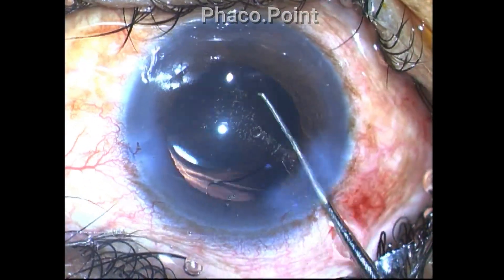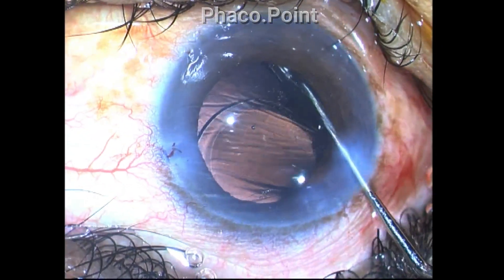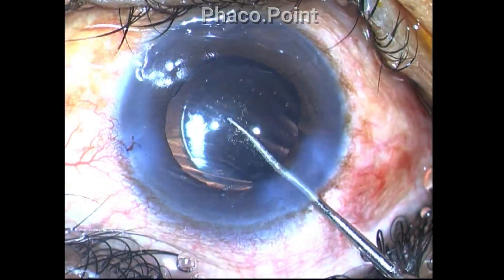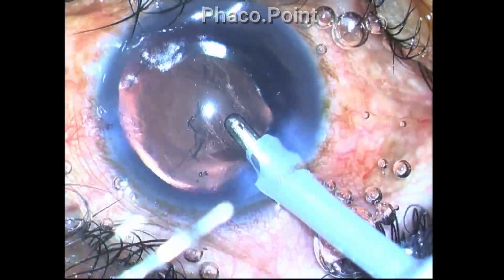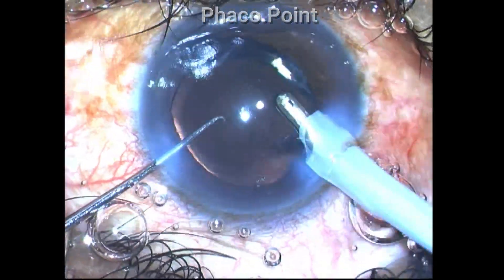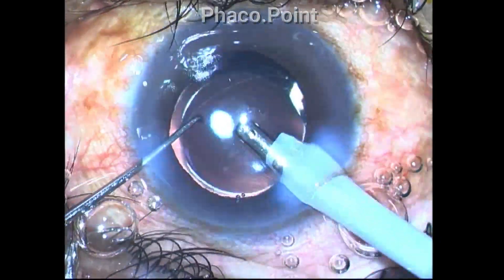It is at this point that I realized what the real problem was. When I tried to dial the lens, I found that the leading loop had punched a hole in the equator of the capsular bag. When I pulled it out of this small hole and dialed it to the horizontal position, the lens automatically centered. The discussion here is an inferiorly subluxating intraocular lens — the cause most likely being a break in the posterior capsule, because if there was an inferior zonular dialysis, the lens would have decentered in the upward direction.